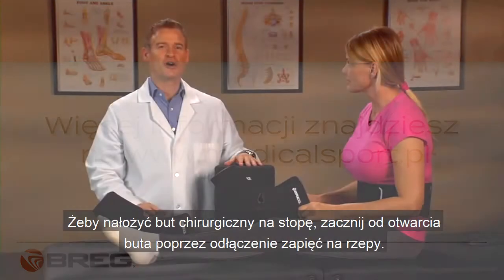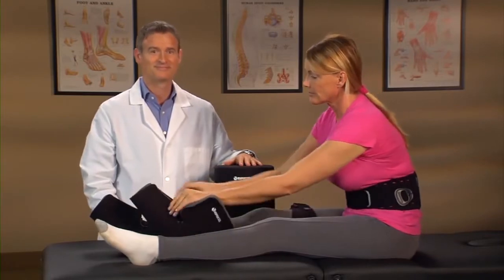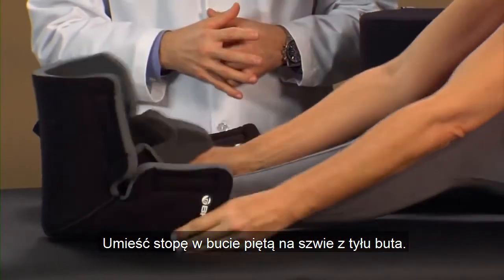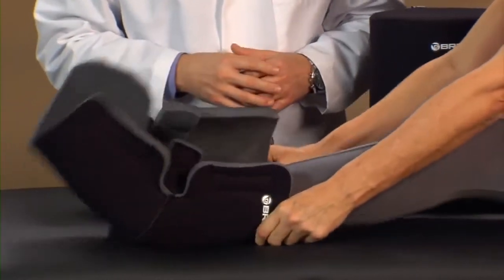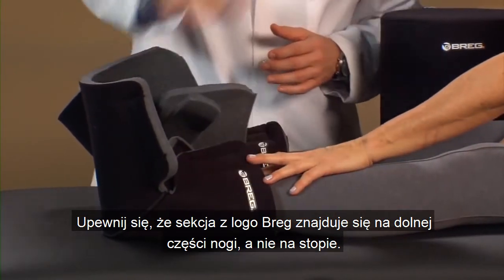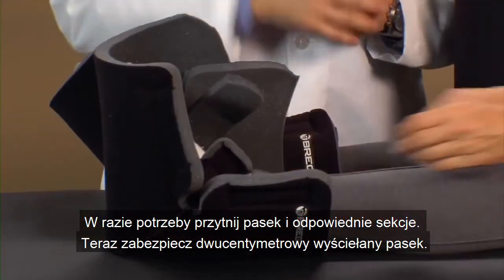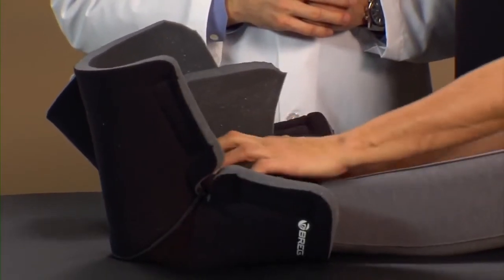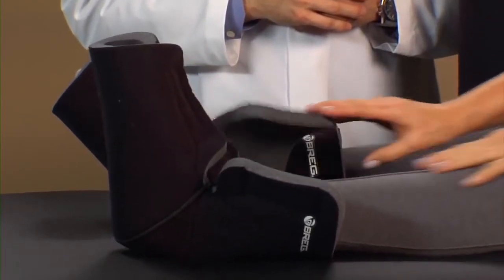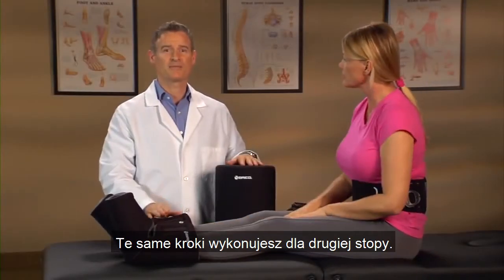To apply the surgical boot onto the foot, start by opening the boot by detaching the hook and loop fasteners. Place the foot into the boot with the heel against the seam of the back of the boot. Make sure the section with the Bregg logo is on the lower leg, not on the foot. Trim the strap and boot sections if necessary. Now secure the two-inch padded strap, then the foot portion of the boot, then the lower leg portion of the boot. Follow the same steps for the other boot.